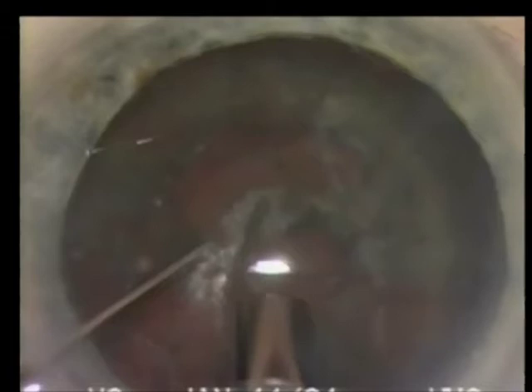One must be gentle with this technique when using topical anesthesia. If necessary, the lens can be rotated just with gentle nudging with the irrigation aspiration tip to achieve optimum centration. For my second case, I will demonstrate another variation of crater chop. Instead of chopping the nuclear rim completely into all the segments before removing any of the segments, in this case I will remove each segment as it is chopped.